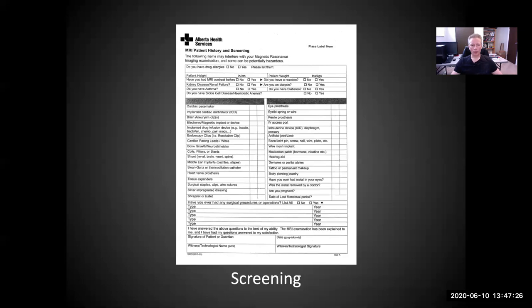MRI contrast is not really an issue for us, as well as most of these others. However, we should be looking out for someone who has any kind of serious medical issue, and that would probably disqualify them from the study. If they do have ordinary asthma, we should know where the inhaler is, and it should be with them in the console room for the study.